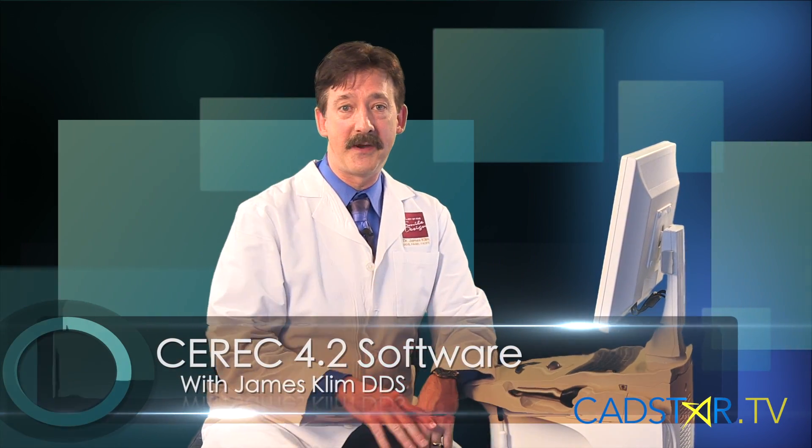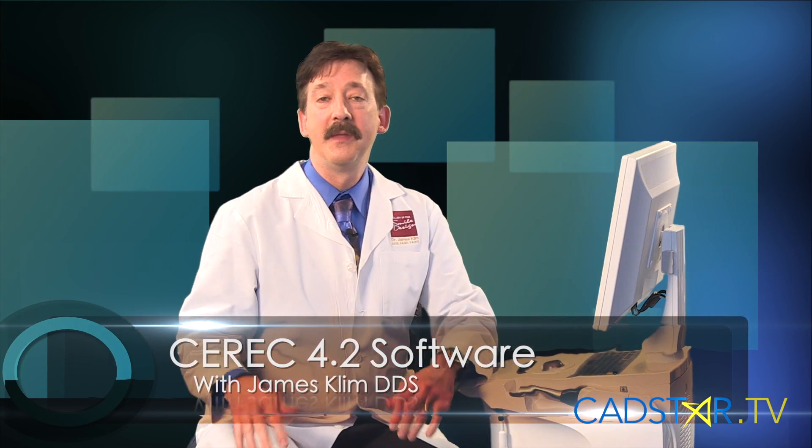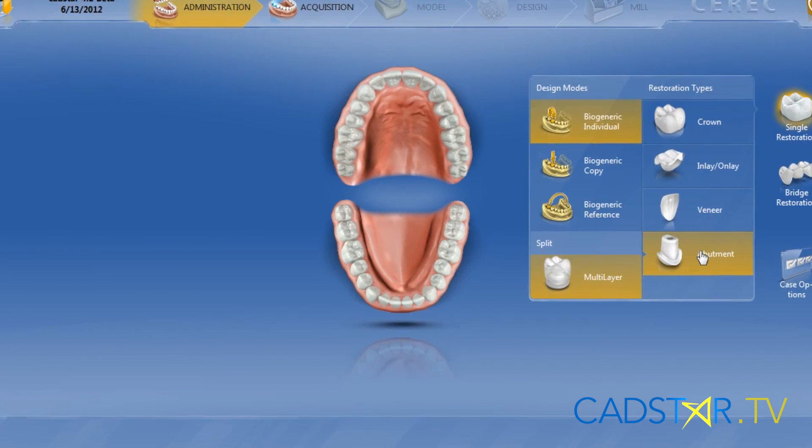Hello my fellow CEREC colleagues — and even if you're not a CEREC colleague, this is going to be a great time to share together. The 4.2 software is out and it's incredible.